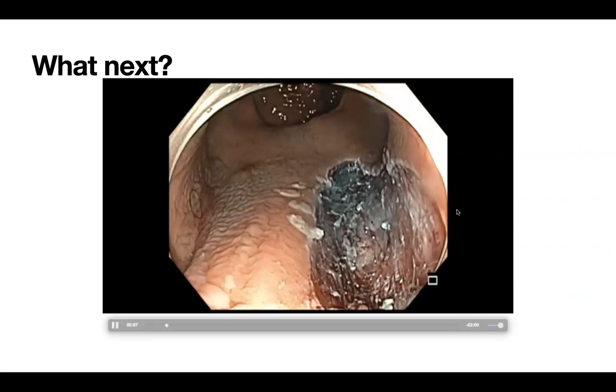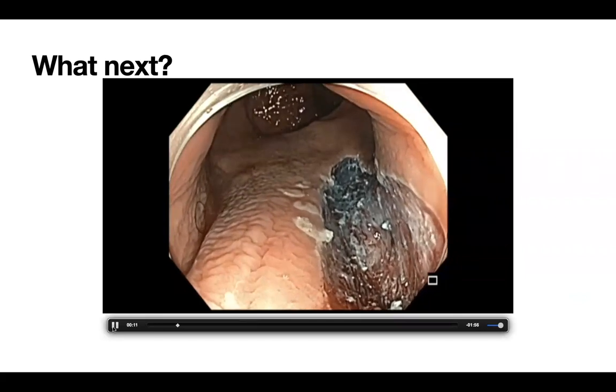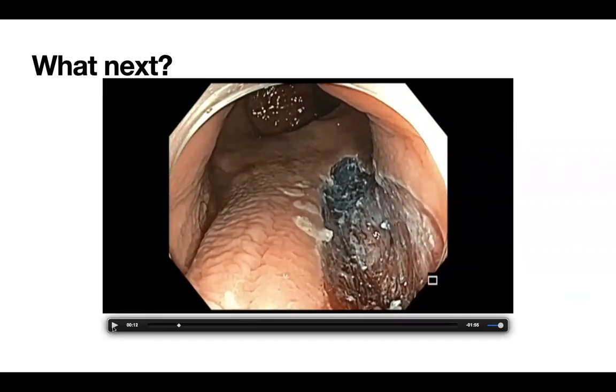So the question now is, what are you going to do from here onwards? APC. Okay. Do we need to though? Because you included a liberal margin of normal tissue when you marked it, and you cut mostly outside the margin of those markings. Which means that the margins are expected to be free.